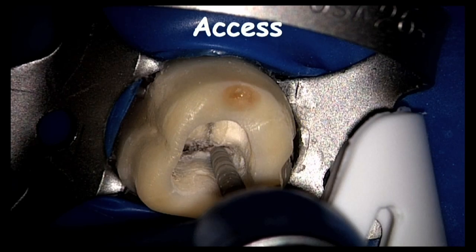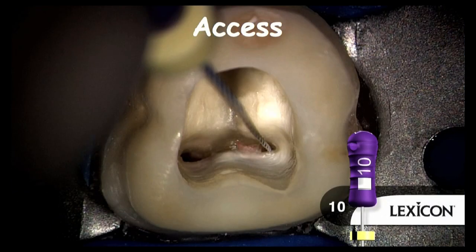First of all, universal, of course, nothing to do with Next, is access that you basically check off. Okay, I'm done. If you're finding you're having to change the access halfway through the shaping, you need to do that sooner. And Cliff Ruddle taught me to finish, and not go to that next step, John, until you have it absolutely perfect. Then you're going to follow that entrance down and begin the glide path. There should be no restrictive dentin for a small file.